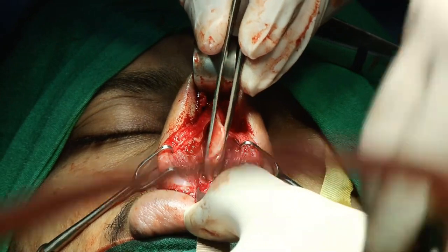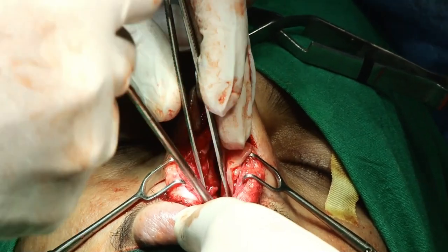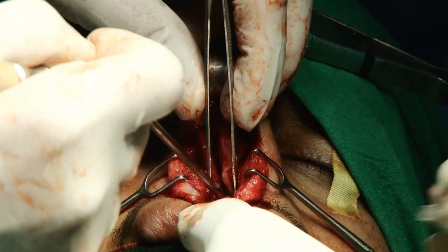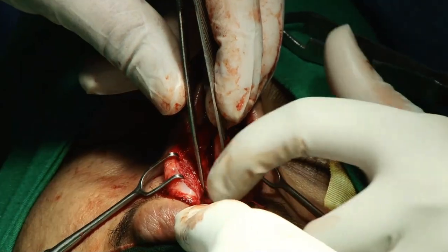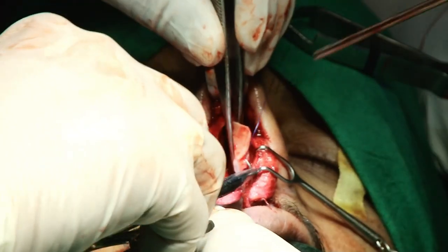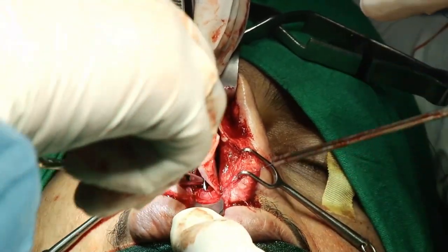So first you identify your anterior nasal spine. Sometimes in some cases your anterior nasal spine is not in the center, then first you correct it and then you suture it. So this is my anterior nasal spine. By the periosteum of this anterior nasal spine, I just fix it. Hold this, keep the suture behind. So we just pass this through the periosteum of this anterior nasal spine like this.